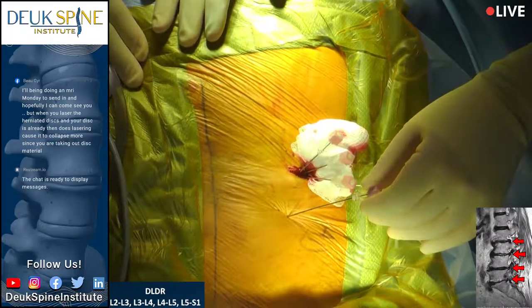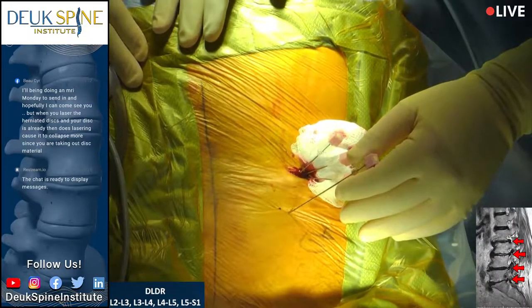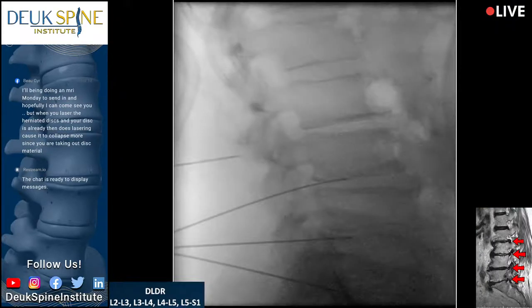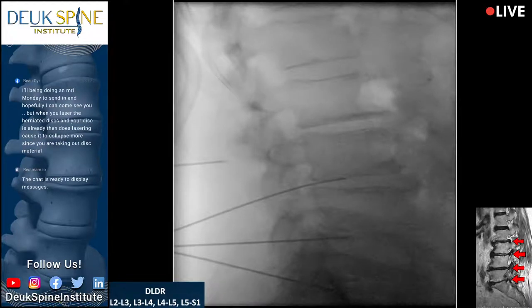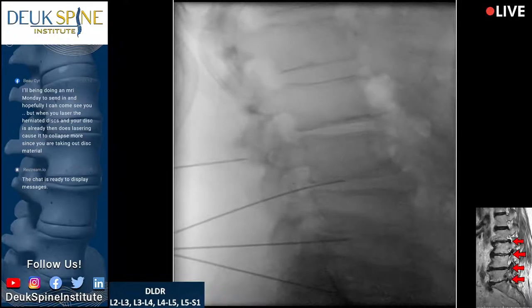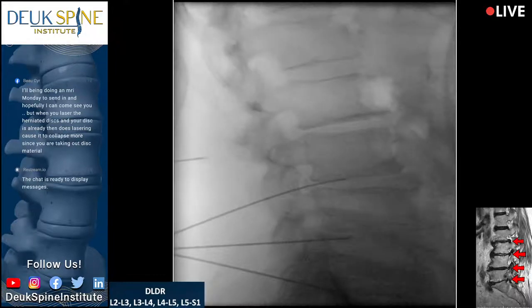So I'm actually touching the facet joint. I need to be a little bit higher. So far everything's going well for him, but he's got severe arthritis here and his facet joints are massive. So this is the L2-3 needle. Because I'm hitting the facet joint, I am moving a little bit more lateral each time, so that I can get a better approach to the disc.